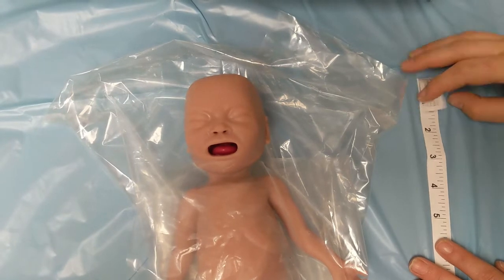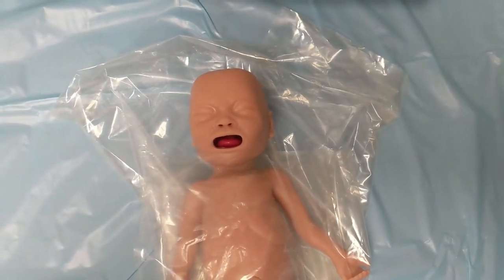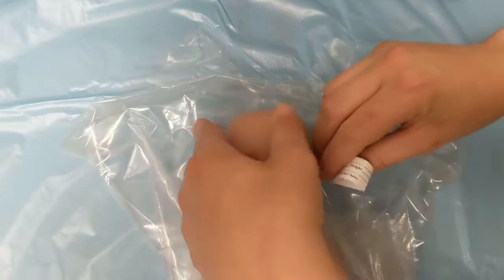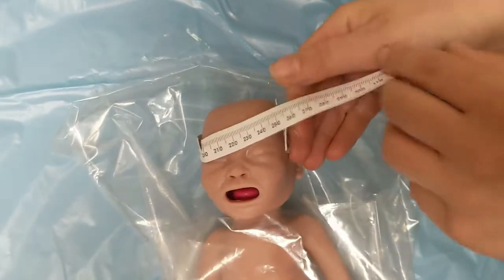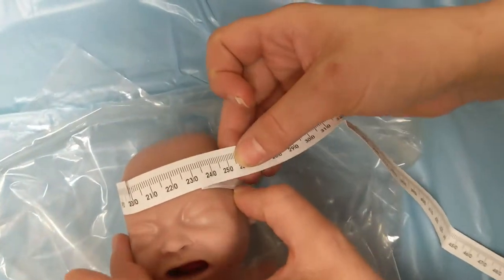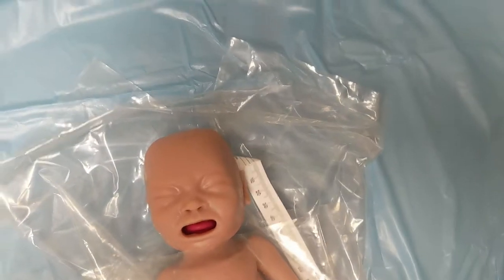A little bit about prong sizing for our babies, for our bubble CPAPs. The first thing we do when putting on our flexi trunk interface is measure our OFC. This baby looks at about 23, so we'll probably go with this hat.